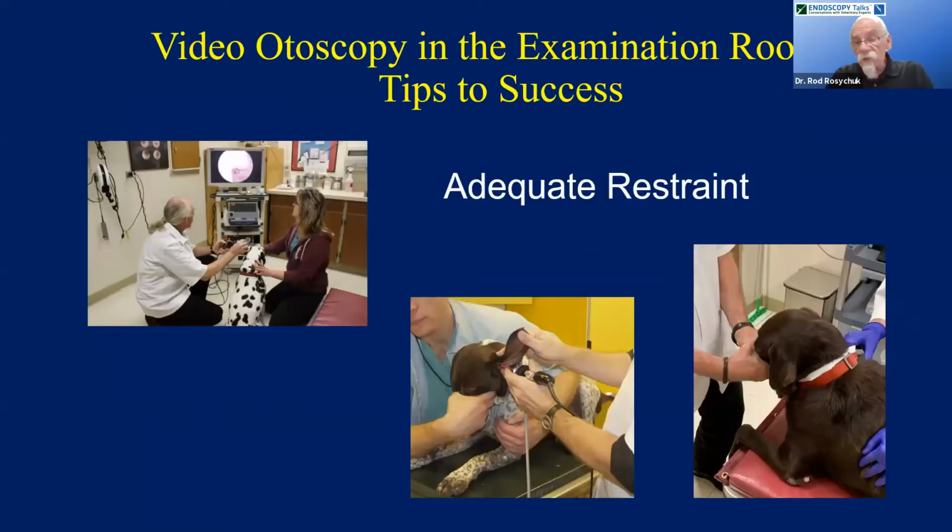As far as tips to success, I do think that in the exam room adequate restraint is very, very important. It is very well worth the time to have a technician come into the room to just basically restrain the individual. That is very important in order to get that exam done. But as I said, it is well worth the technician time. Sometimes it does take somebody with experience doing a two-hand hold on the nose, moving the nose slightly into the thoracic inlet so that we can get a good direct shot into the ear.